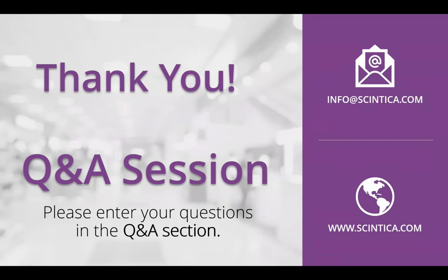It's a great question. So if we think about sound in and sound out, which is how we use ultrasound, that becomes quite challenging to be able to get through the bone with both sound going in and sound going out. The lower the frequency of the sound, the easier we can penetrate the skull, but often we're trying to look for smaller structures. So if you're imaging the brain, a better option would be to consider something like MRI, CT, PET. It really just depends on what you're looking for, but ultrasound is not the best technique.